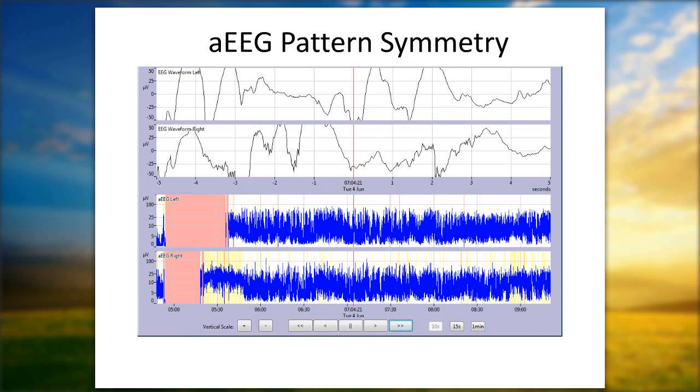Looks the same, exactly. So in this case, although I could look at maybe 0600 and say, oh, well, the lower margin is maybe 3 at 0600 on the right, and then maybe at 0600 it's 4 on the left side, when you look at the overall pattern for left and right, they are both continuous. So there are differences, but they are the same pattern.